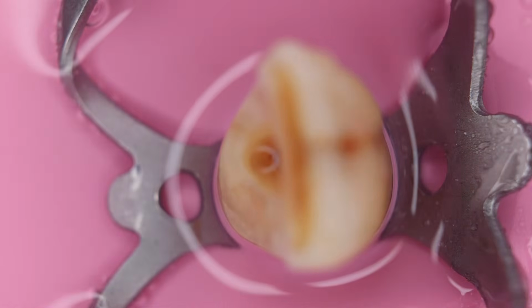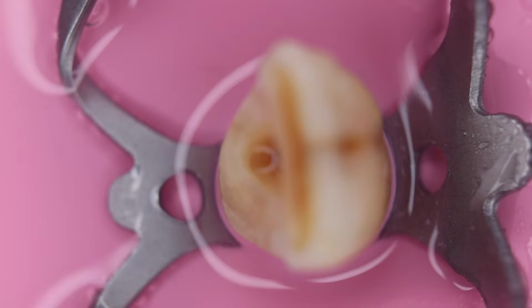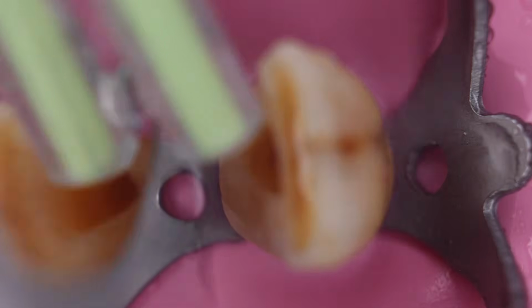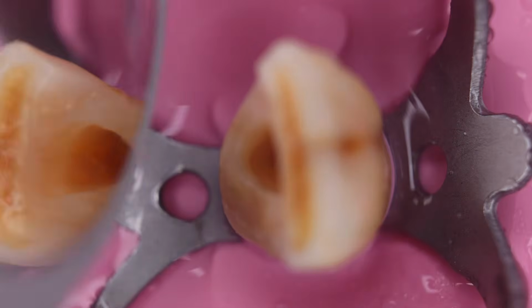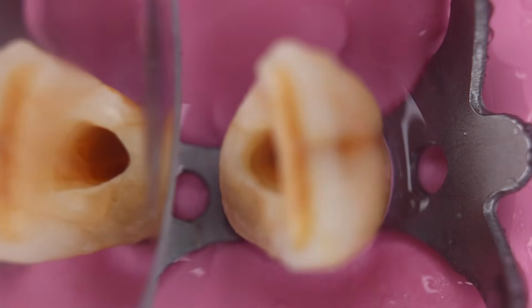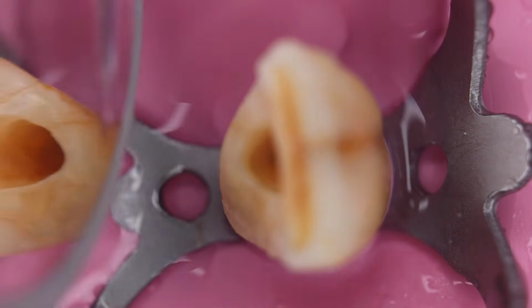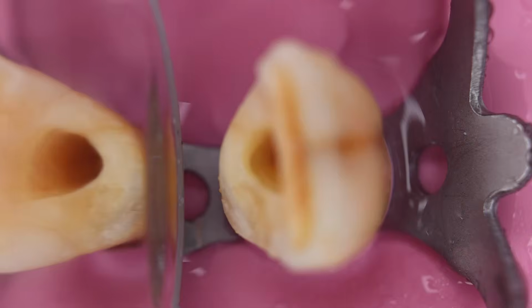And done. This is your final preparation, or the access cavity preparation, that you should be keeping in mind. Now you can appreciate the triangular access with an orifice that you can visually see and have negotiated the canal. So this should be your approach with a straight line access, walls forming the triangle, and safely going into the central incisor. Hope this was useful to you.